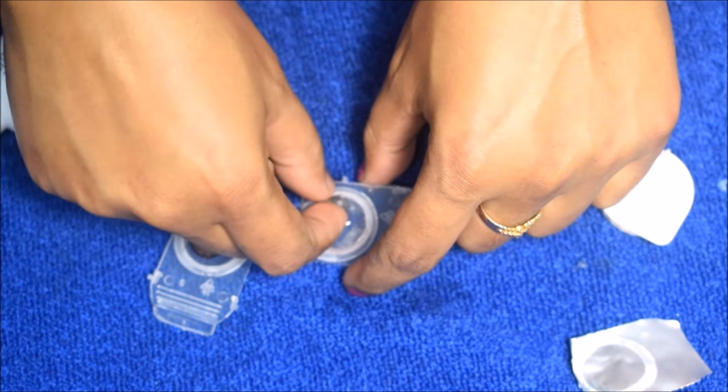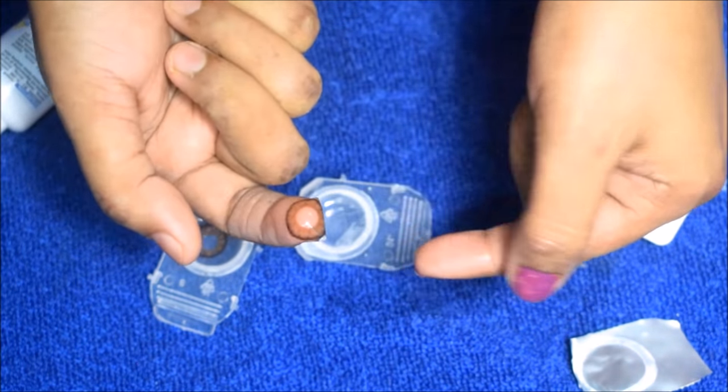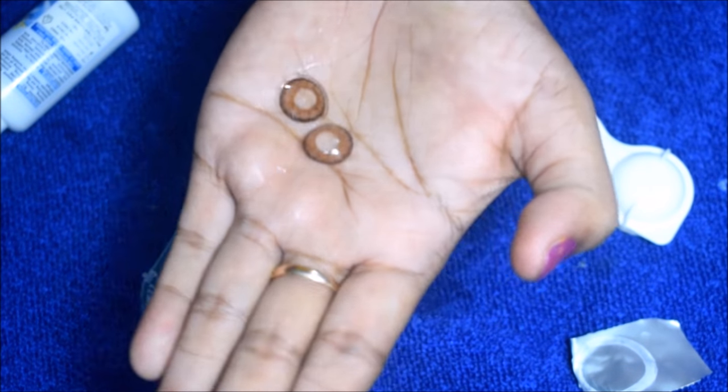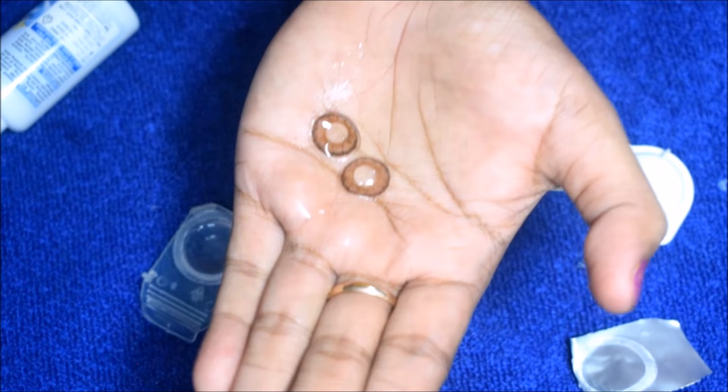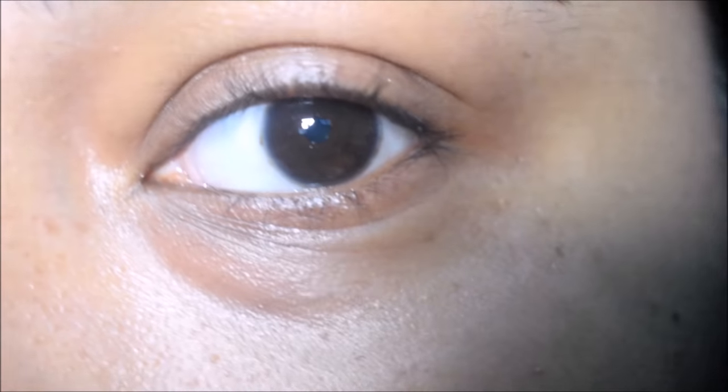So, this is the lens, guys. I am using it for the first time — it is not necessary to clean it. So, I will show you first how to apply it.